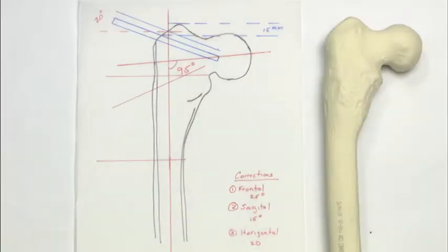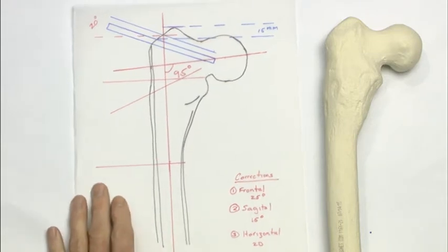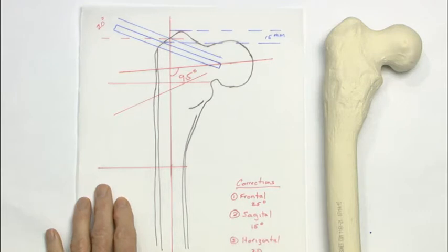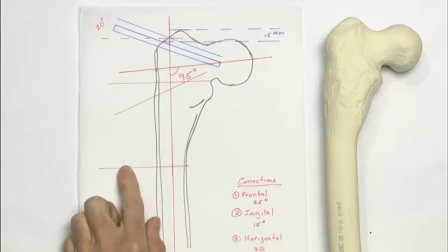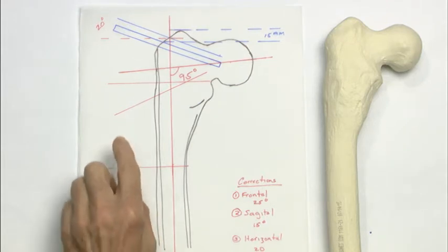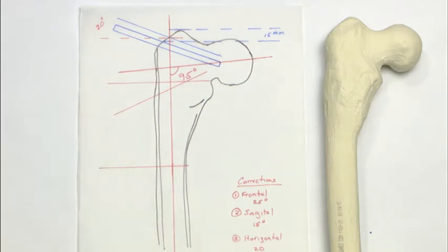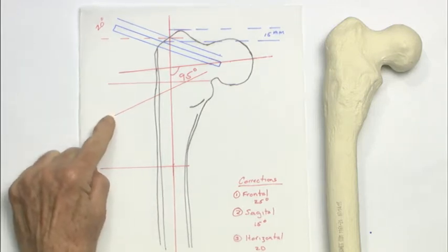So we're now at the point that we want to transfer our preoperative plan as we have it depicted here on the left with reference Kirschner wires and a seating chisel path. So we have a reference perpendicular to the long axis, a reference at this point which will be essentially the transverse plane for the first osteotomy, one of a variety of references which we can use for our 25-degree closing wedge.